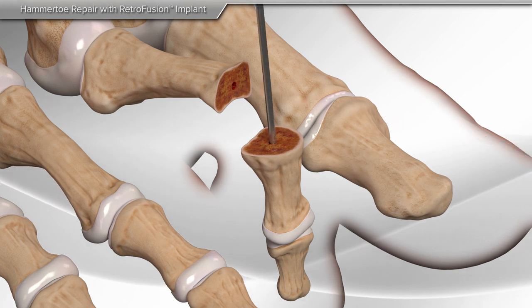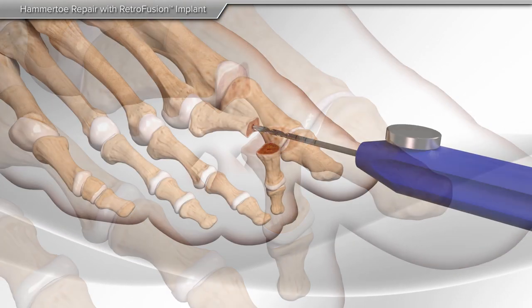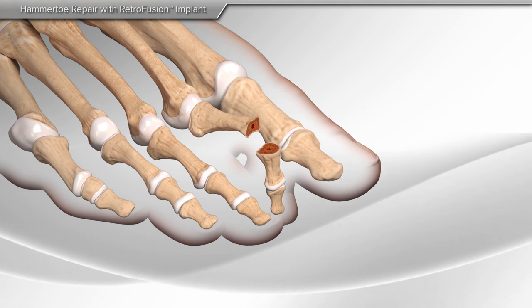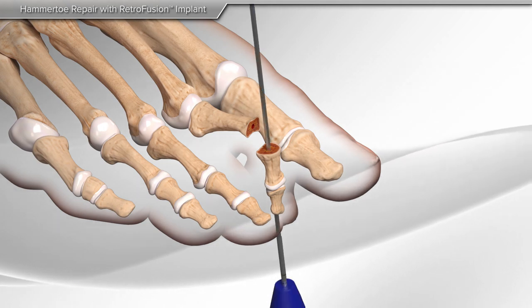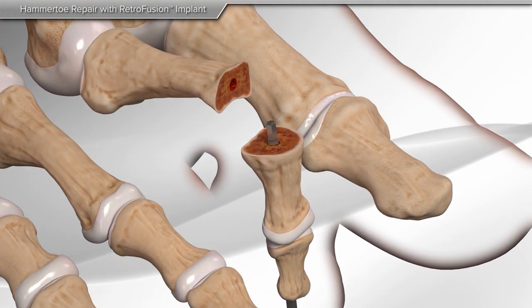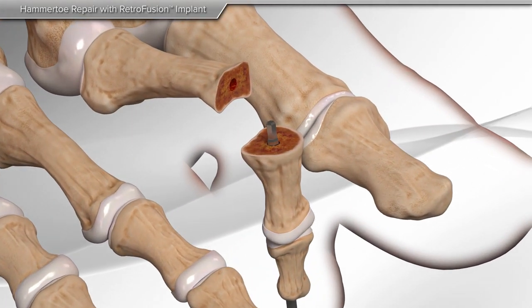Next, a guide wire is used to mark the center point of each bone. A hand drill is used to prepare the bones for the retrofusion screw. The second drill bit is left in place, and the back end of the drill bit will be used later to engage the screw, similar to a screwdriver.